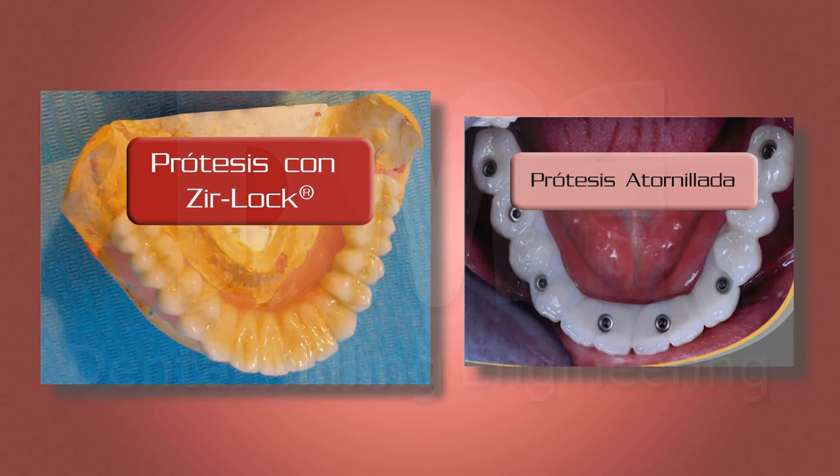It is known that all the labor problems to protect and seal the screw holes start here. Remember that every time the patient comes for cleaning, the doctor will have to remove the ceramocomposite, clean and remove the screws, replacing those that were in bad condition. Clean, screw back, and finally seal a new setting of occlusion with a polished ending of the shutter.